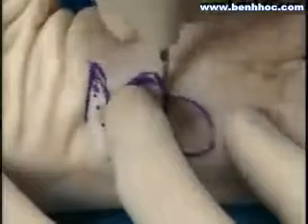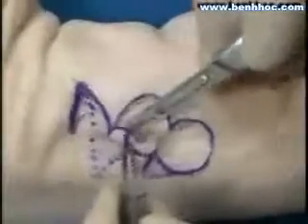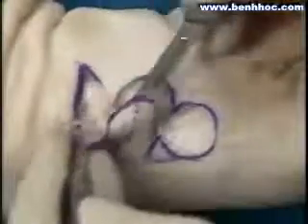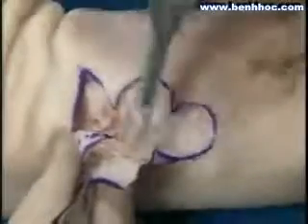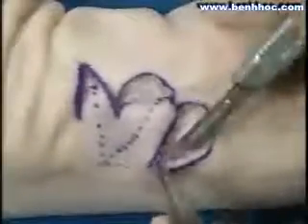The reason the angle or triangle needs to be removed at the apex of the first lesion is so that that first flap can be rotated into position. We're undermining the second flap now, actually wide undermining, either with scissors or 15 blade is necessary to allow the rotation. Again, wide undermining. The triangle to be removed is also undermined, and the area of the lesion is now being undermined.